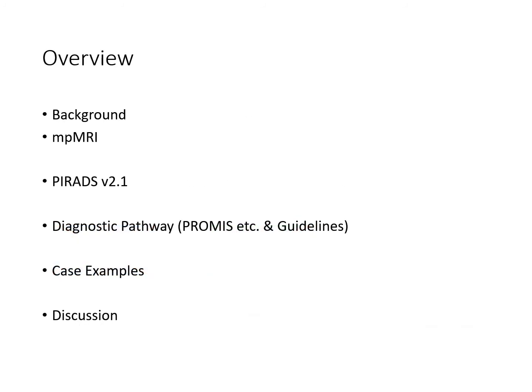Just an overview of the talk. Firstly, I'll give you some background information. Then I'll explain about multi-parametric MRI and what that entails. Then I'll touch upon the updated PIRADS scoring system. Then the next main topic will look at how MRI, correctly used, should fit into the diagnostic pathway. There's an important study called PROMIS, and a few other studies, and also the guidelines internationally. Then I'll give you some case examples of different diagnoses, and then there'll be time for discussion, inshallah.